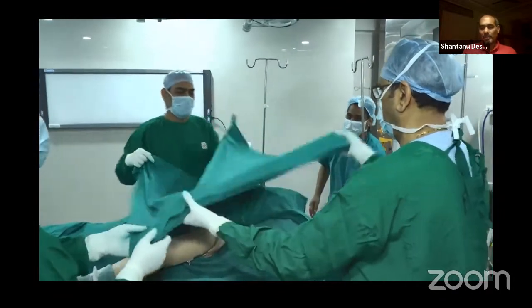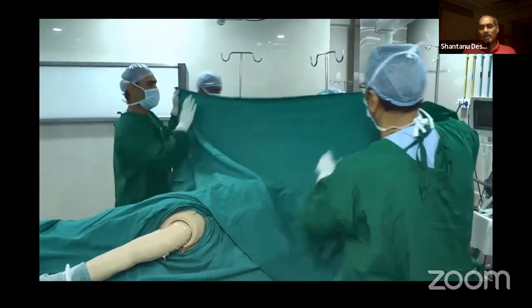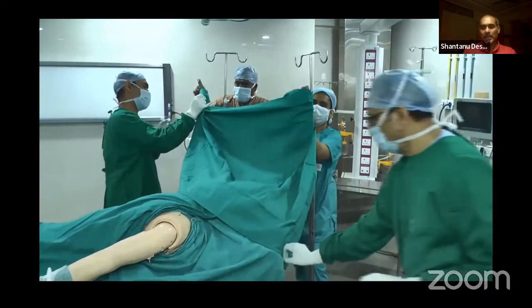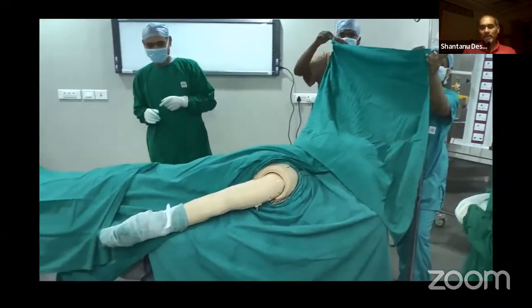Now the final drape comes for a curtain across the anesthesia site, covering the tube or head end of the patient.